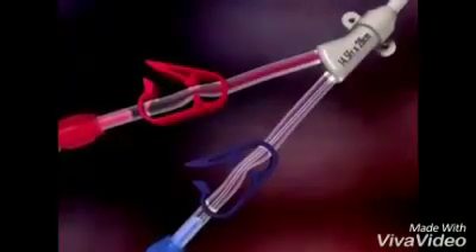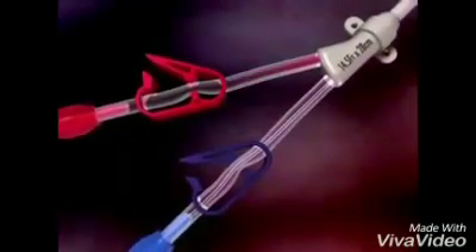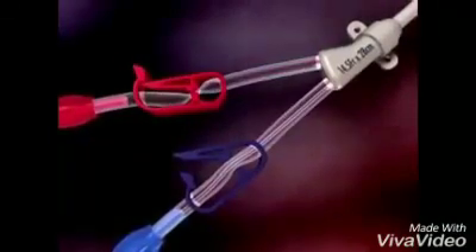Gently lead the catheter-tunneler connection into the tunnel. When tunneling is complete, remove the tunneler from the catheter. Do not pull the tunneler out at an angle — keep the tunneler straight to prevent damage to the catheter tip. Flush the arterial lumen of the catheter with saline and clamp the extension.